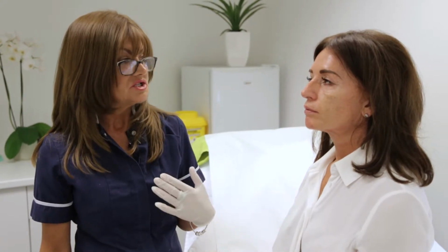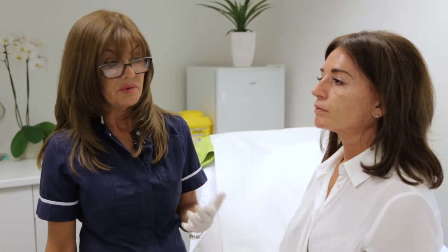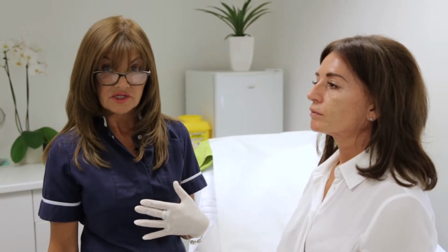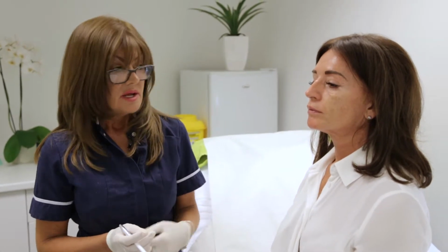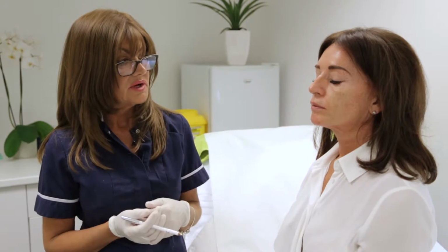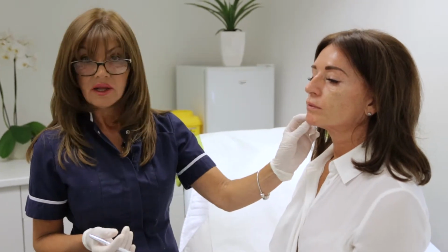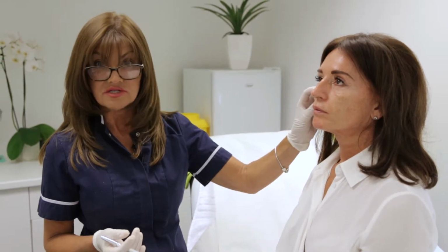So even though we're injecting Babs today, that's not the result that she'll get. She'll come back in probably 3 months, let us have a look and take the pictures, and then at 6 months, because over that period of time it's getting better. The areas that we're actually looking at is where she's lost some volume on the cheeks. This is not a superficial filler, but on the fine lines on the areas around this area here, they will look as though they've improved as well, but we're targeting more the hollow areas on her cheeks.